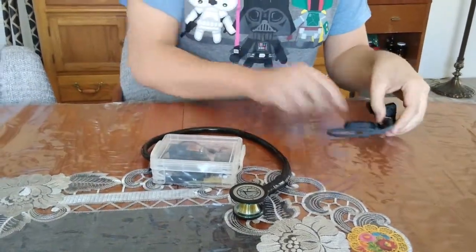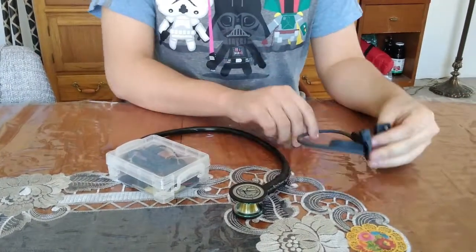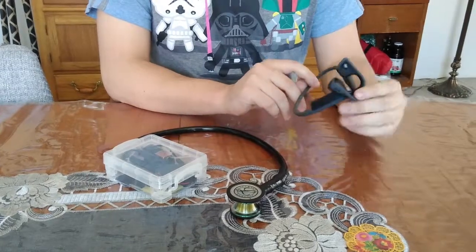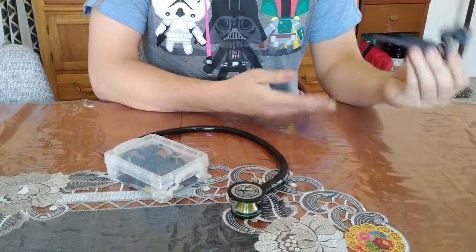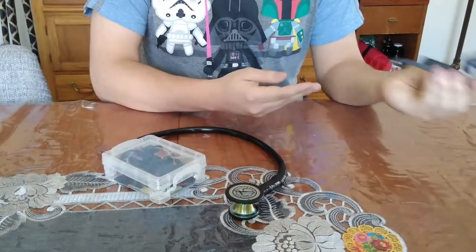The third part is the Bluetooth transmitter. We have it connected to Bluetooth so you can connect it to any headset or any phone with Bluetooth capabilities to hear and record these heartbeat and lung sounds.